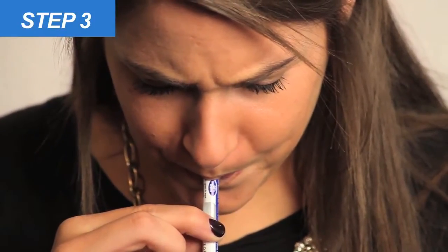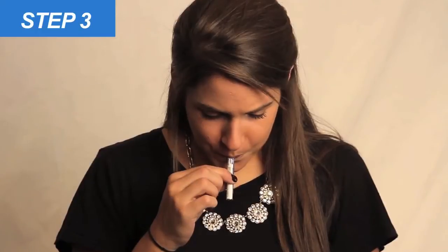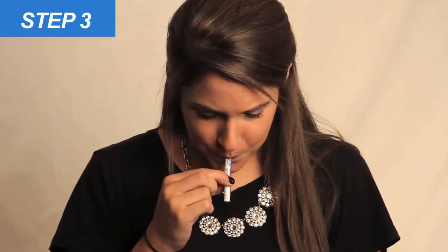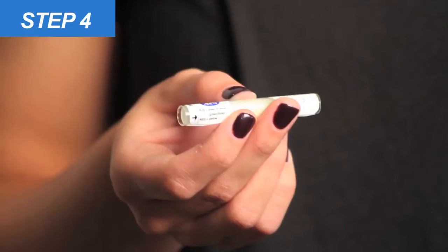Step three: have the subject hold the BreathScan alcohol detector vertically with the arrows on the blow end pointing down. The subject should then forcefully blow into the tube in one continuous breath for 12 seconds.